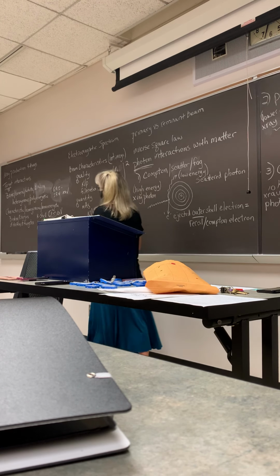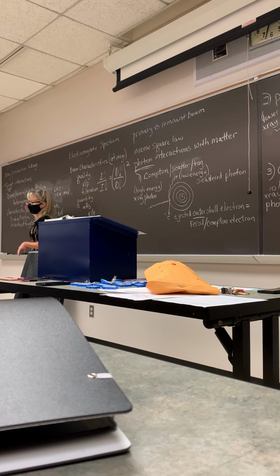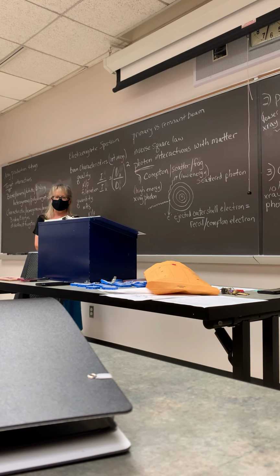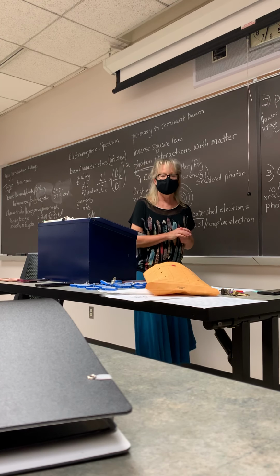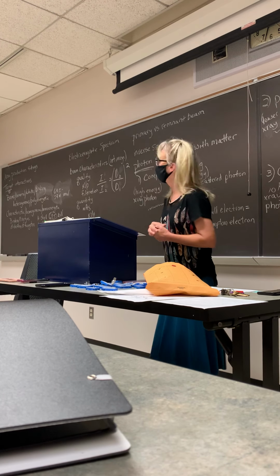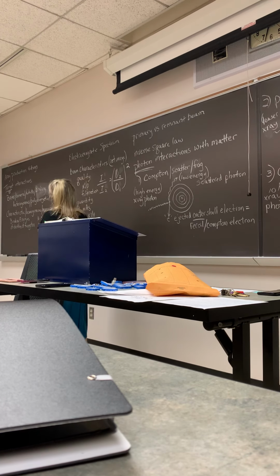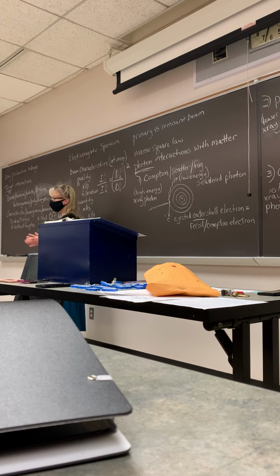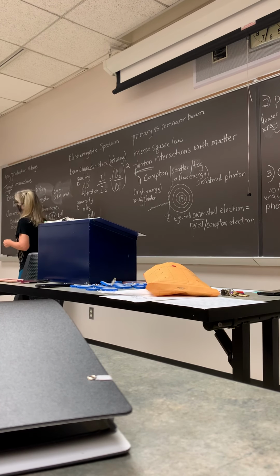Okay, so those electrons slam into the target. 2 things can happen when the electrons slam into the target. The first one, I think, is the easier one. It's called brems. You need to know the other names for brems. Brems, or bremsstrahlung, actually. General radiation, braking, because that's where they slam, breaking. Heterogeneous and polyenergetic.